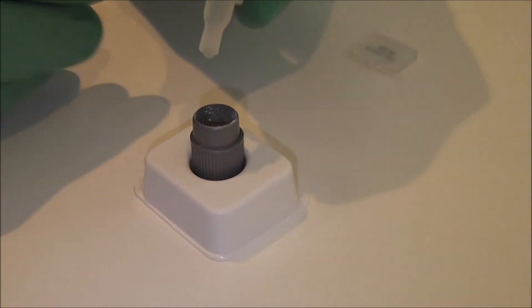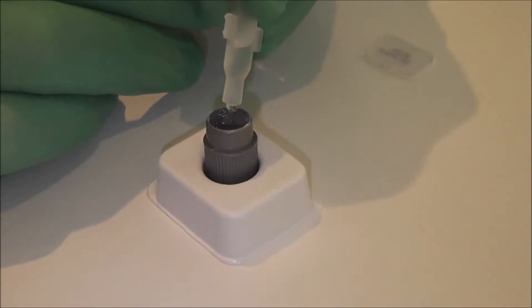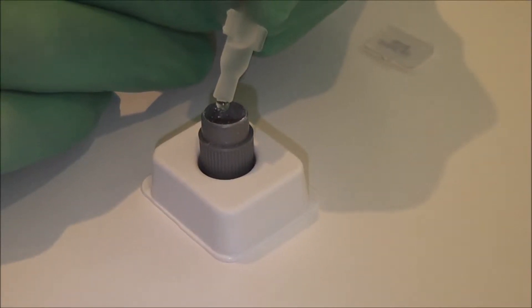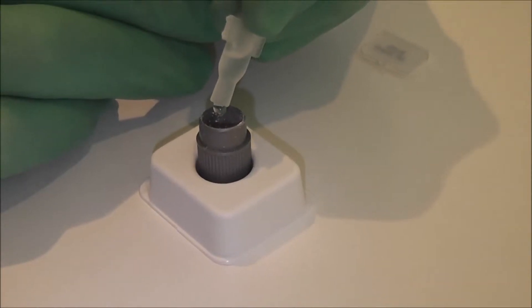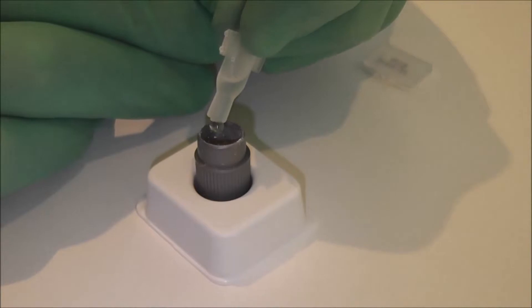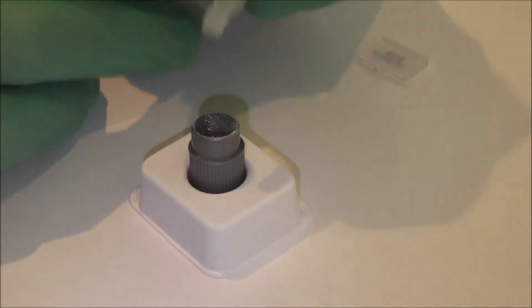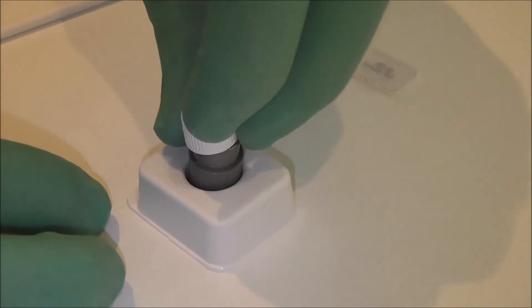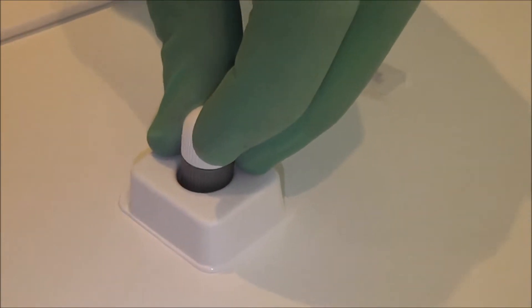This is the powder and liquid mix. We mix five drops of the liquid from the pipette into the powder capsule, and then we replace the lid and mix on the fastest setting in our mixer for 30 seconds.